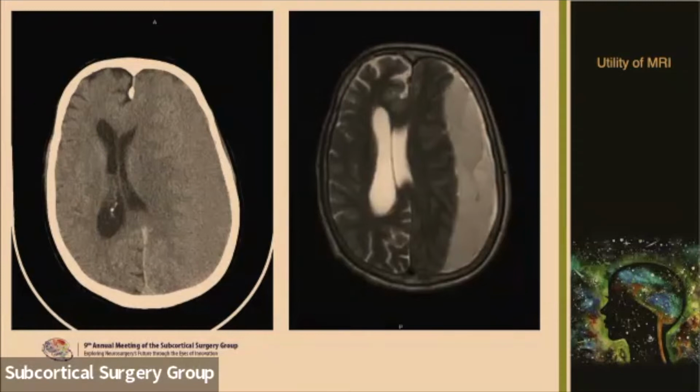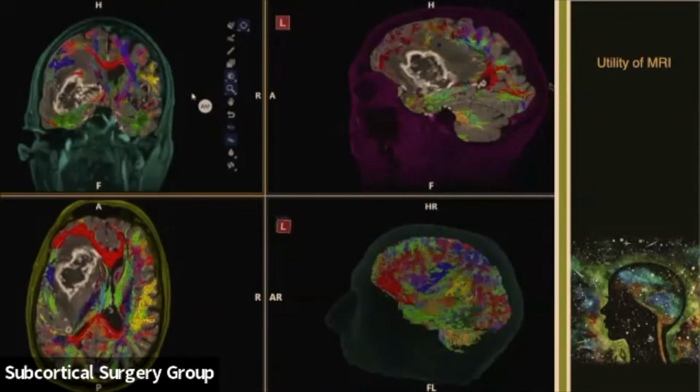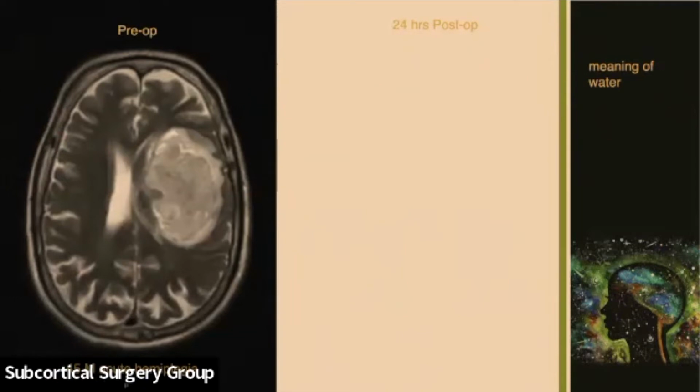It tells me something about membranes. It tells me if it's an empyema and so many other things. So if I can, I always get an MRI. Well, if I can in a tumor, I always get tractography. And to the extent that it's available in your institutions, I don't see the benefit of not using it, because it is like insisting on watching black and white television when you have a color film.